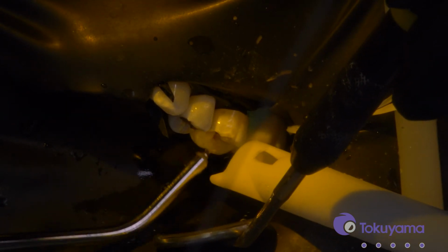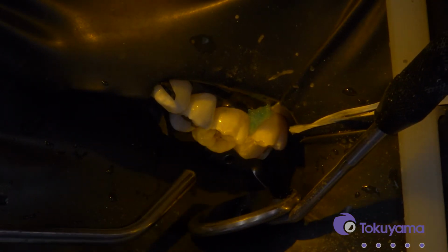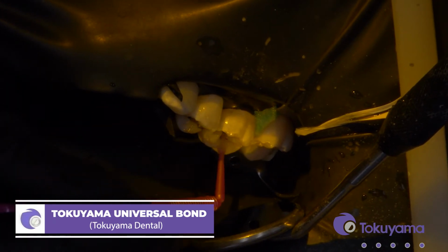Okay, Polly. Let's rinse. One of my favorite additions to my toolkit here is having a syringe that's dedicated to just air. So when I'm drying a tooth prior to bonding, thinning bonding agent, I like to use this syringe. Now this bonding agent also does not require any scrubbing into the tooth structure. So you basically place it and thin it out. No light is necessary here.